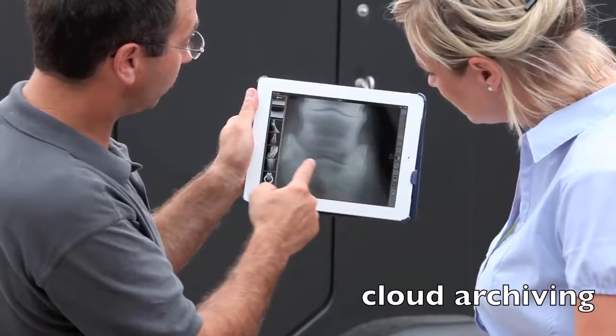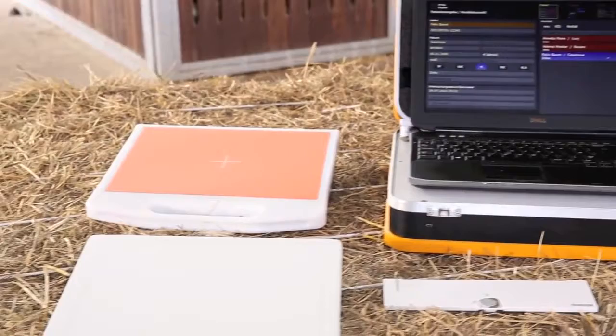The ORCA cloud archiving solution by OR technology provides whatever is required for long-term archiving of examinations. In addition, all data can be accessed worldwide from any computer with internet access.